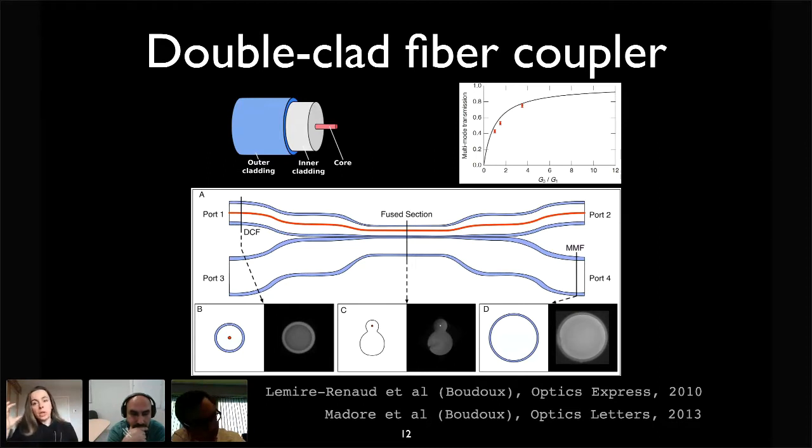But all the photons that are backscattered from the tissue are collected in the inner cladding at port 2, shown in white, and most of them will be redirected to port 3. So by inserting this new device into a fiber optic endoscopic system, you can collect 100 times more photons. They have different properties, granted, but you can exploit the second channel that comes for free, and if you know the properties of light, you can exploit them for different clinical applications.